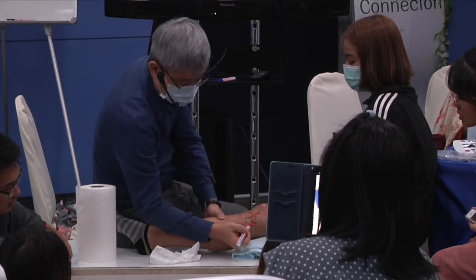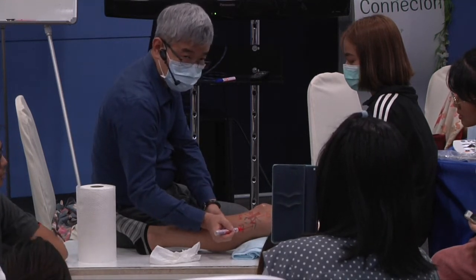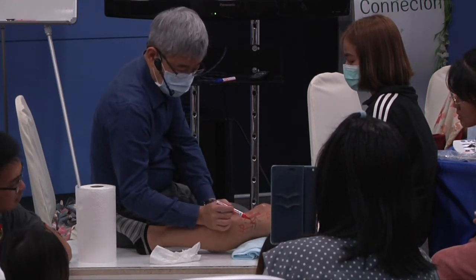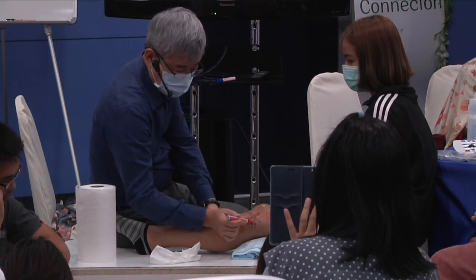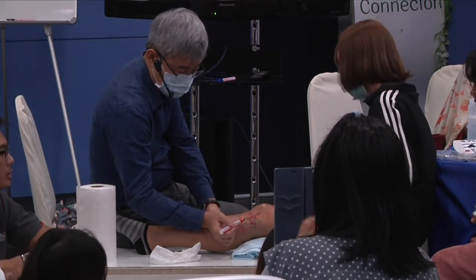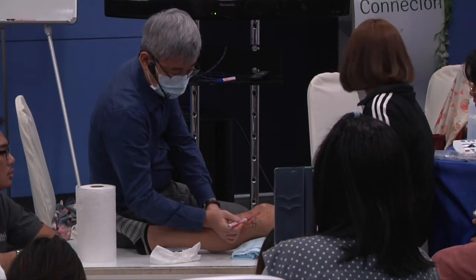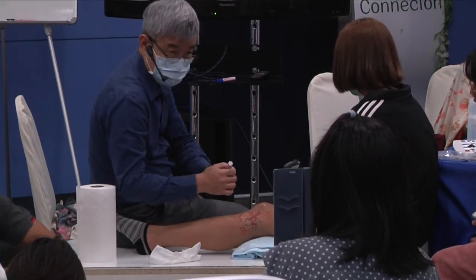There's a small ligament in here; if we cannot find it, it's okay. So we are going to look at the LCL, popliteus tendon, biceps femoris, and the lateral meniscus, four structures. They are very, very easy.